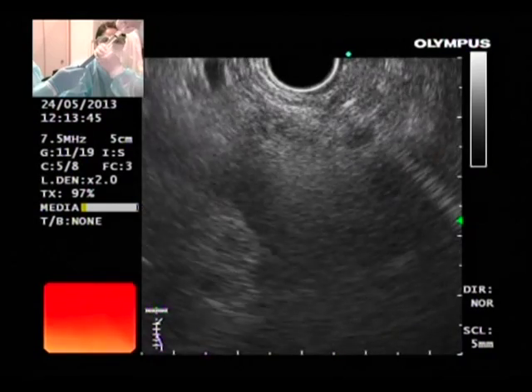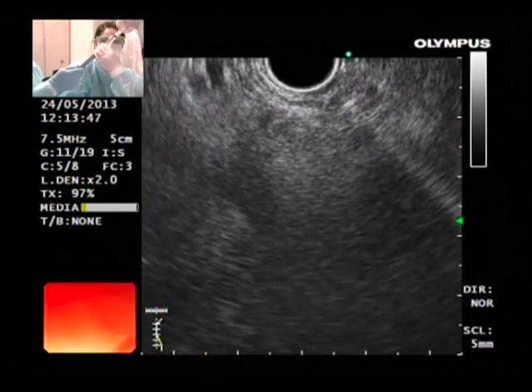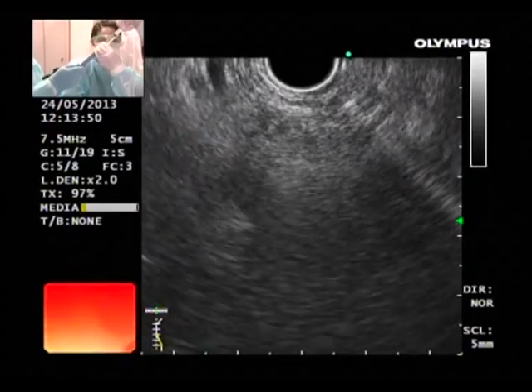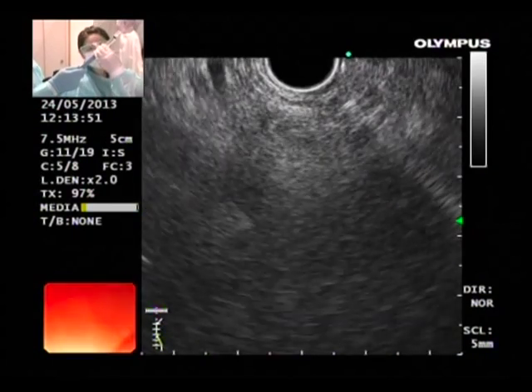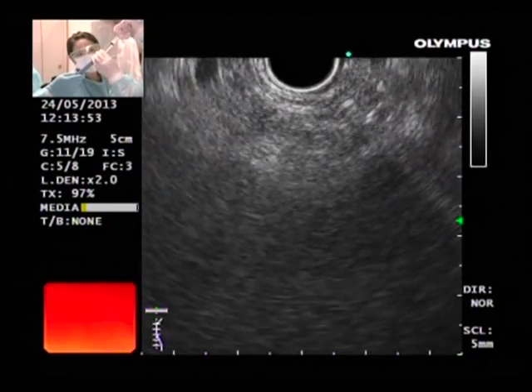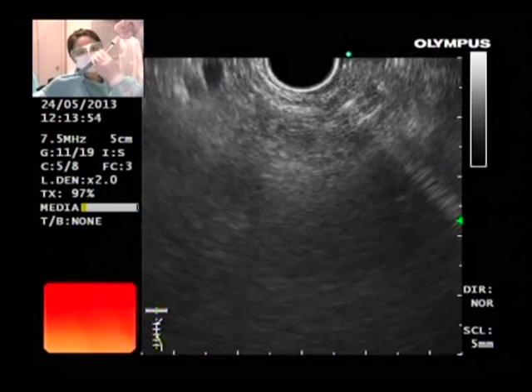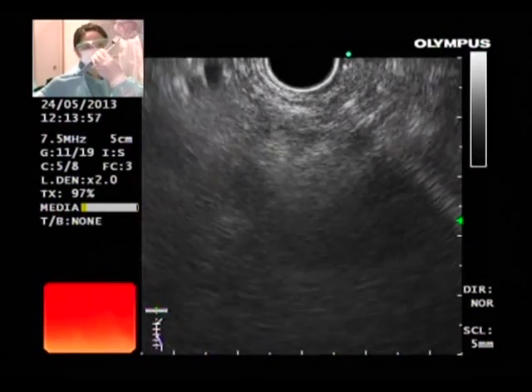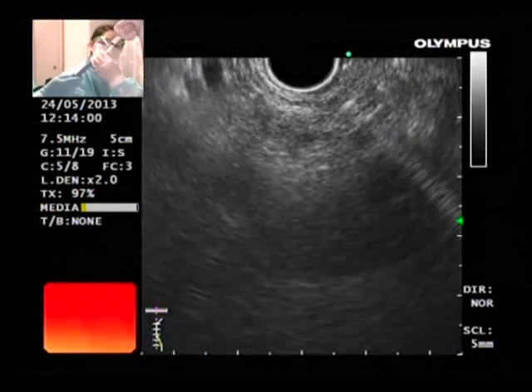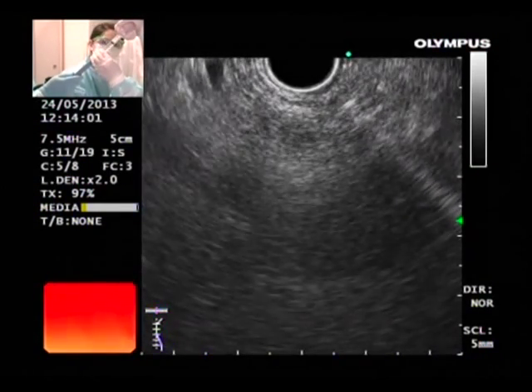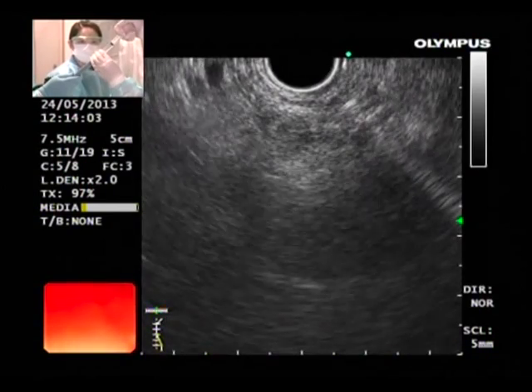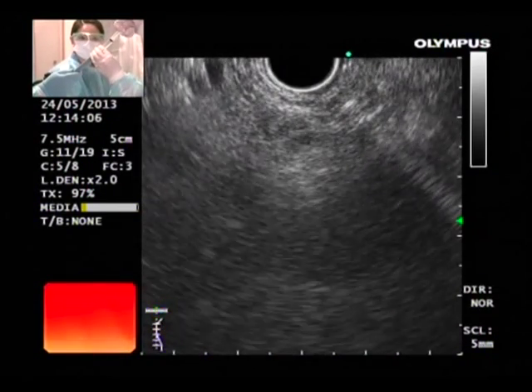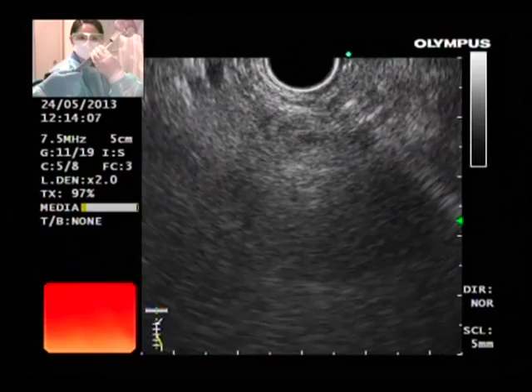Wonderful. Excellent assistant. We have injected 3 cc so far — 2 more? What do you say — is it enough? Yes, 2 or 3 cc's is enough. So we stop.